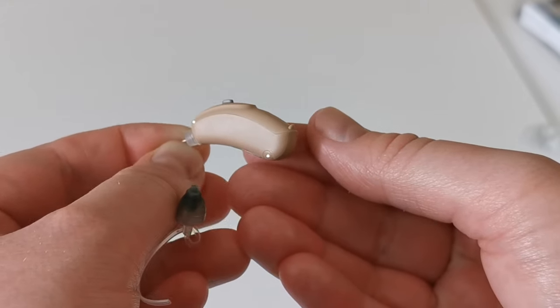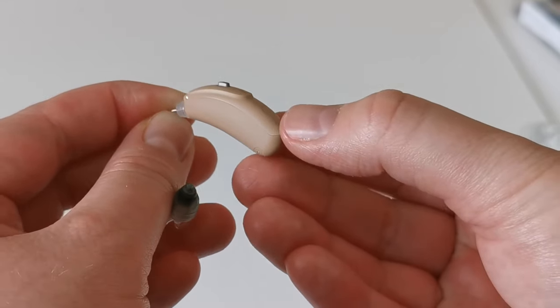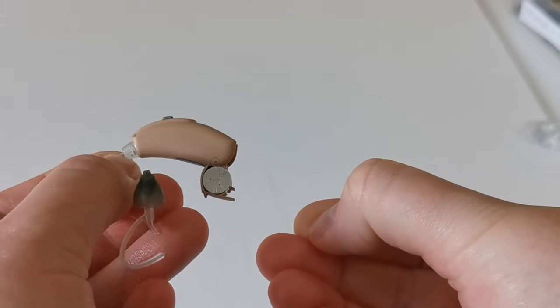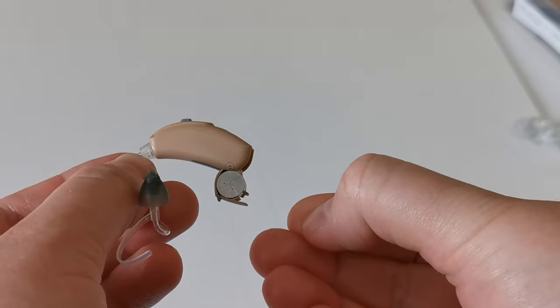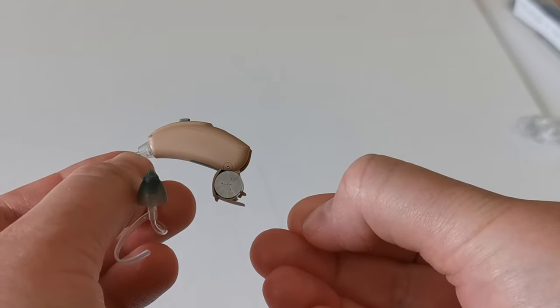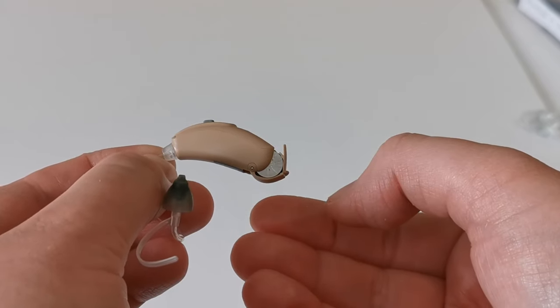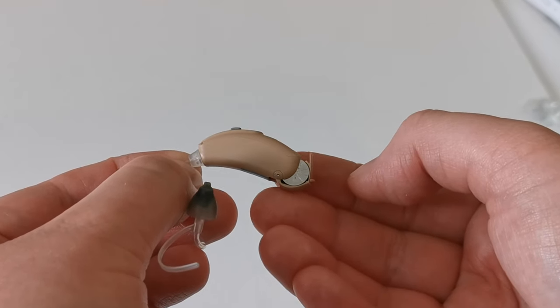To turn the hearing aid off, you need to open the battery drawer by using your nail to pull on the lip of the battery drawer until it is open. It is important to turn the hearing aid off to maximise the potential battery life.